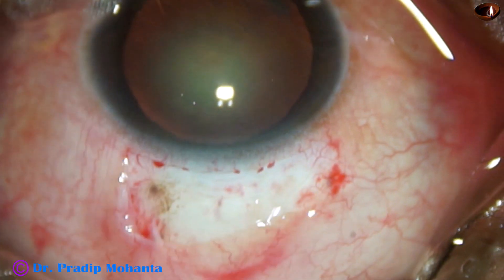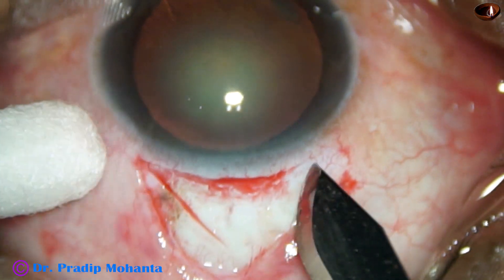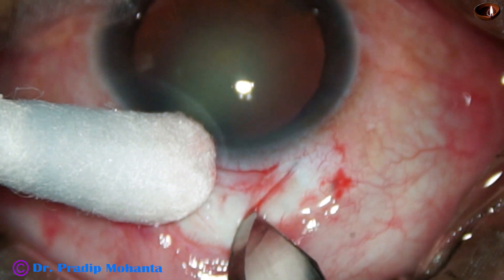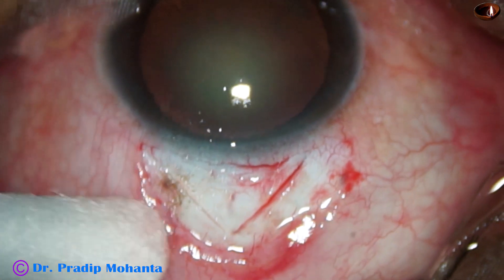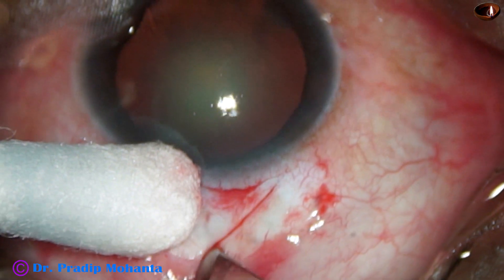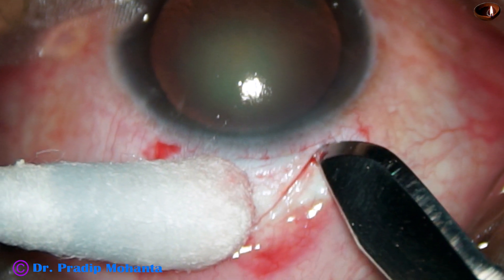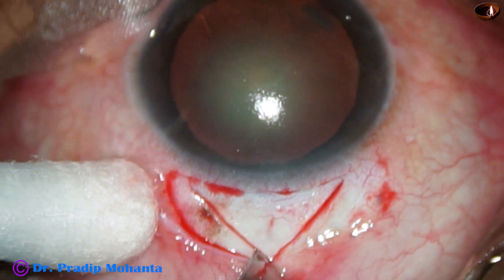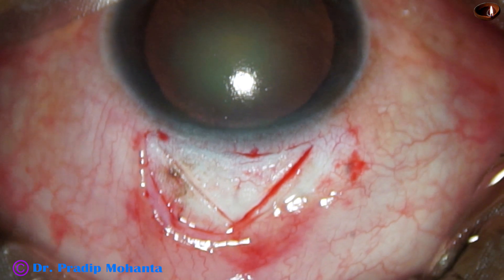A triangular area has been selected. And now this is the incision — a triangular incision with its base at the limbus. And now this is almost a half-thickness incision.